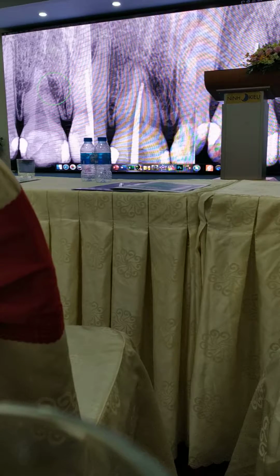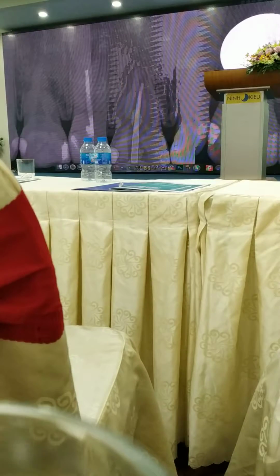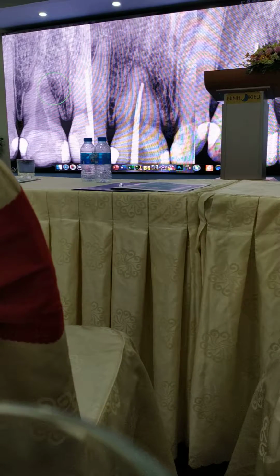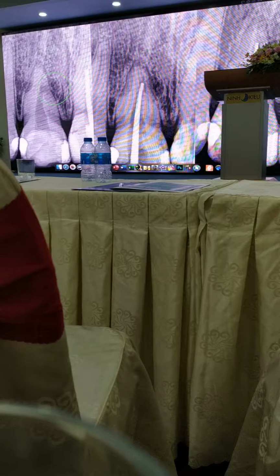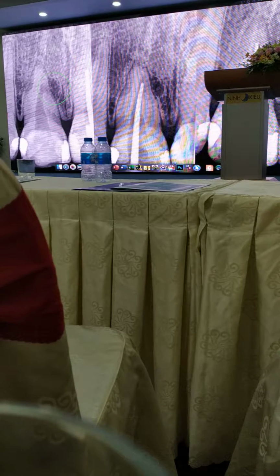I will obturate until this level, because depending on the bioceramic sealer, after 4 hours or after 24 hours, the material gets really hard.